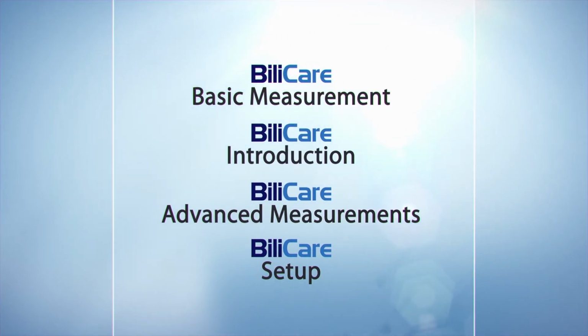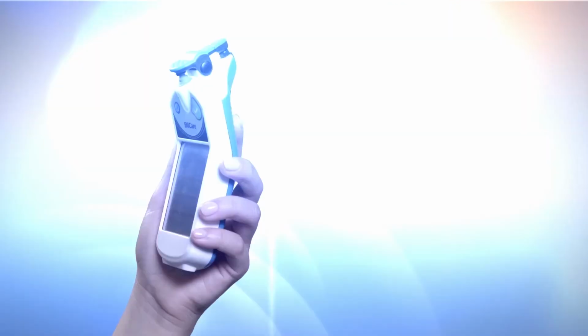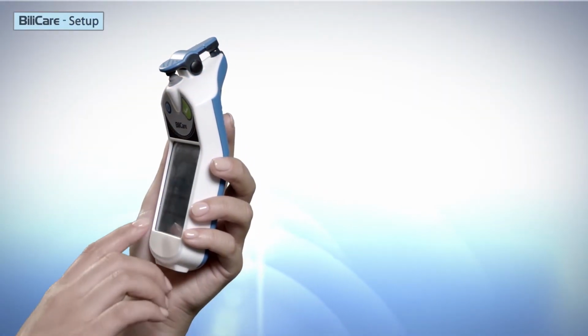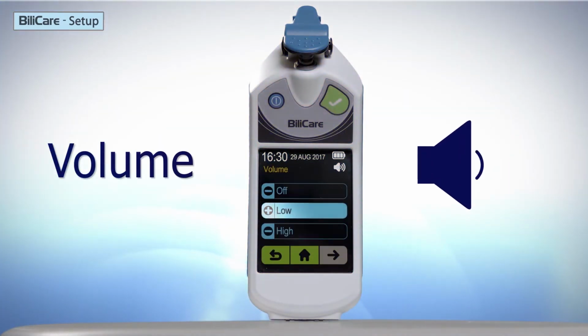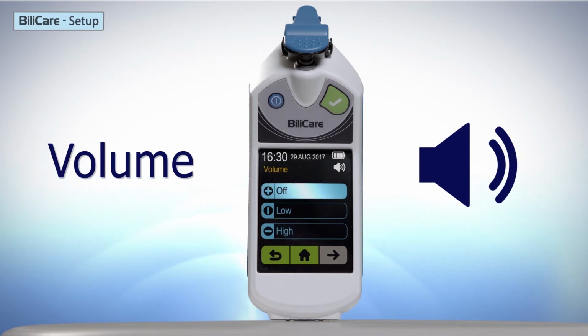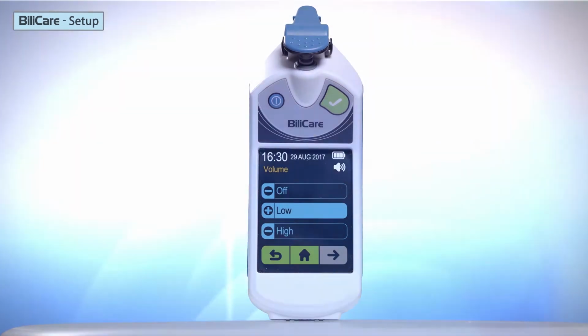In this video, we will show you how to set up the different BiliCare options. Let's press Setup in the home screen. Following are the available settings options. The volume may be low, high, or off. The default is low. We do not recommend working with the beep off.